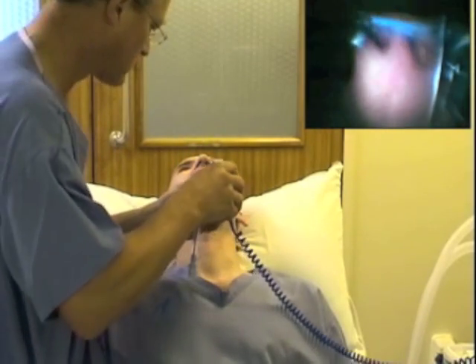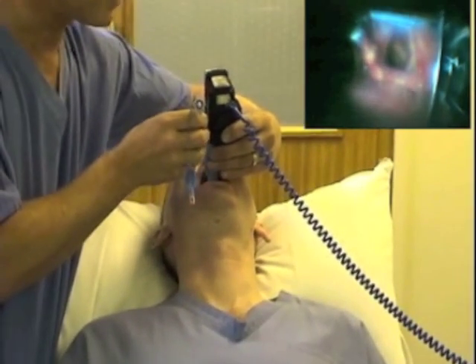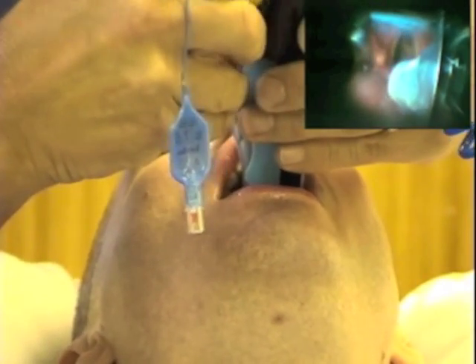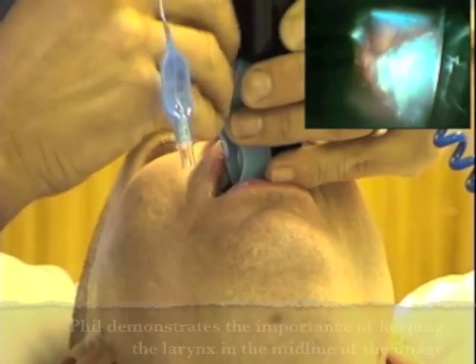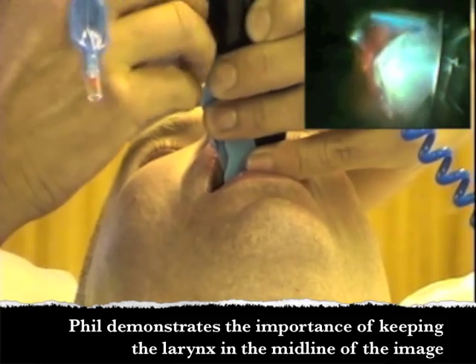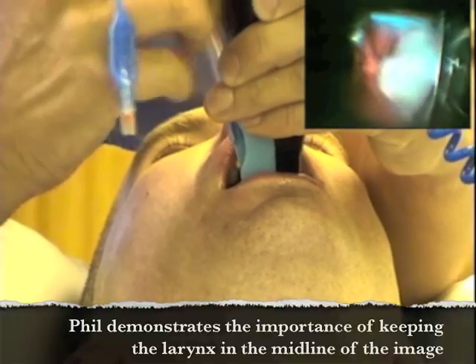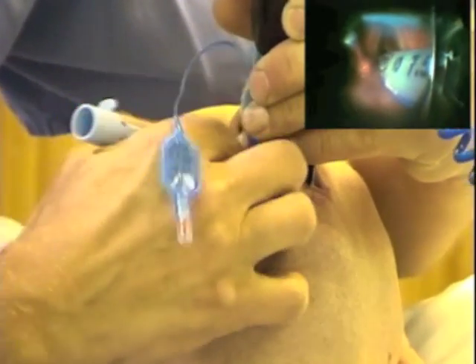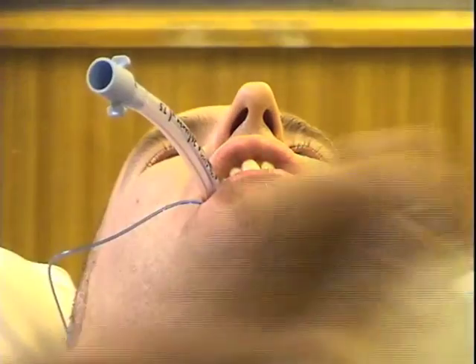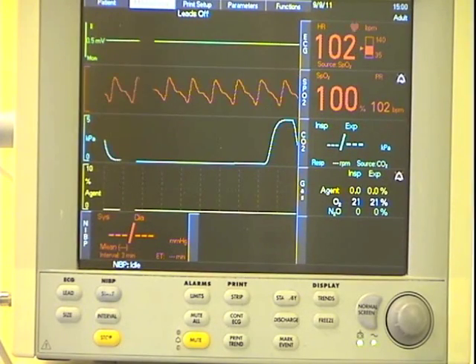I'll pass it in again. Nice, flip to the vertical — and the larynx — and up. I'll just have to pull the side towards the ceiling. Perfect — the tube's down. Put the capnograph on to demonstrate the tube is in place. Take a nice deep breath in and out — see capnography. Nice. Let's get a good capnography trace.